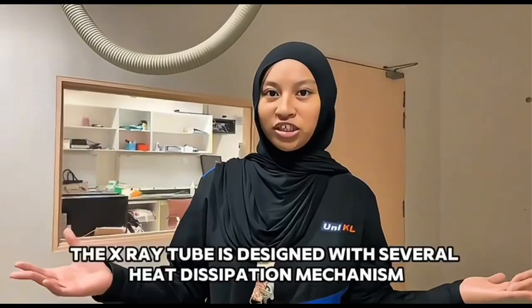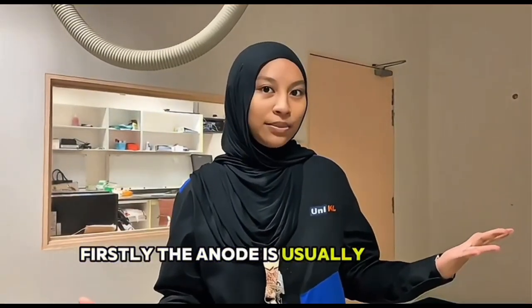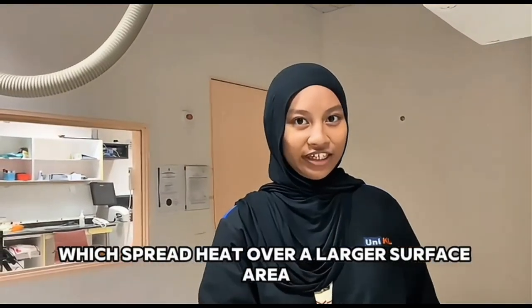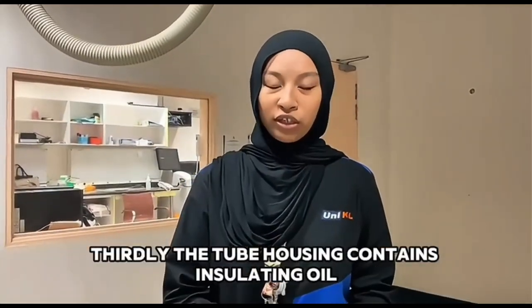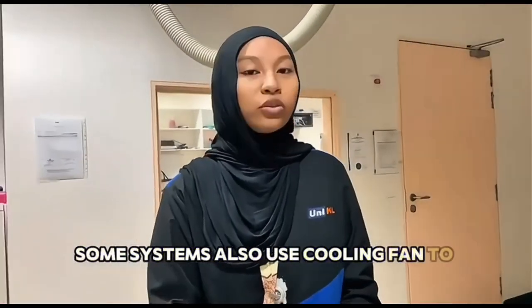How is heat dissipated? To prevent damage, the X-ray tube is designed with several heat dissipation mechanisms. Firstly, the anode is usually made of tungsten, which has a very high melting point. Secondly, many X-ray tubes use a rotating anode which spreads heat over a larger surface area. Thirdly, the tube housing contains insulating oil which absorbs heat and transfers it away from the anode. Some systems also use a cooling fan to further reduce temperature.